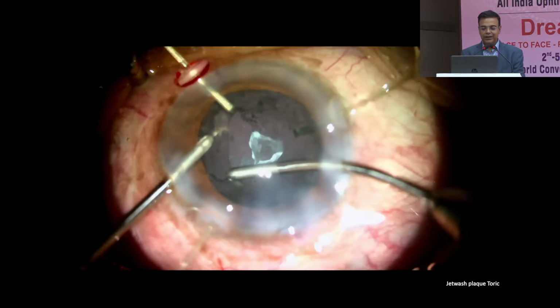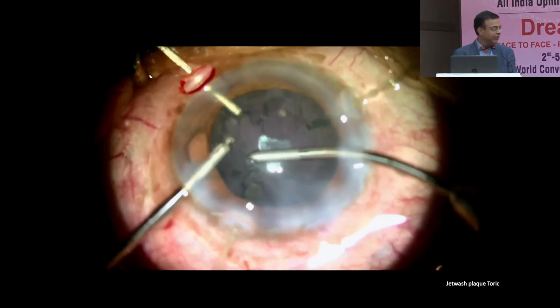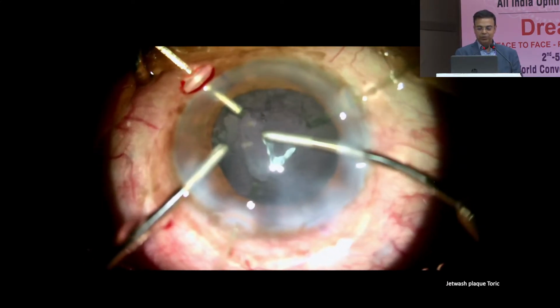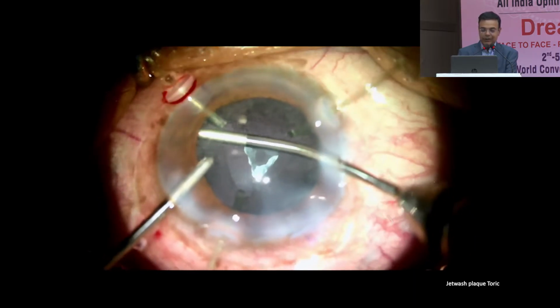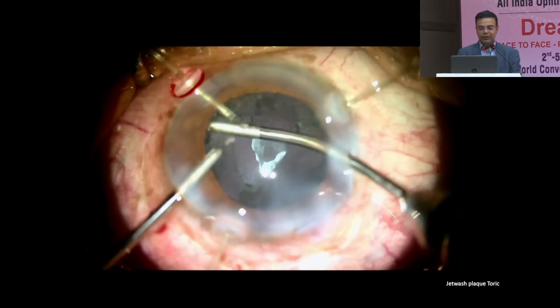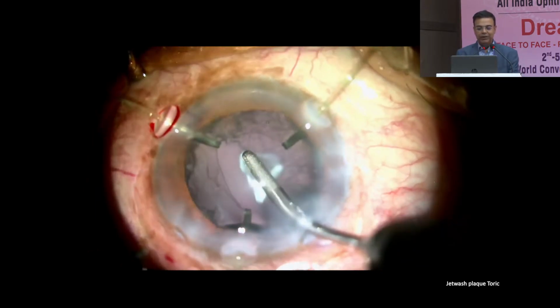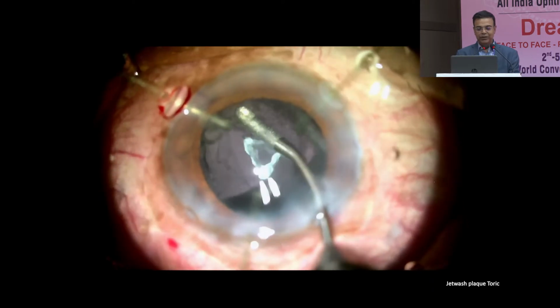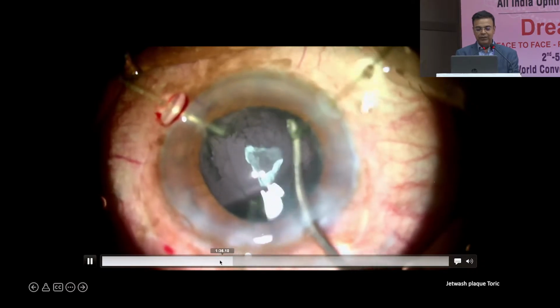And here I know that Dr. Amar would have said, why are you wasting time over this, just get it out and do a scleral fixation. But this patient had 2 prior retina surgeries, and had a detachment which had been sutured. We would have wanted to preserve the bag if possible. So after wasting a lot of time, I managed to clear only a small area which was less than one quadrant. So I went in with this other way, which is something that I've been doing for some time.